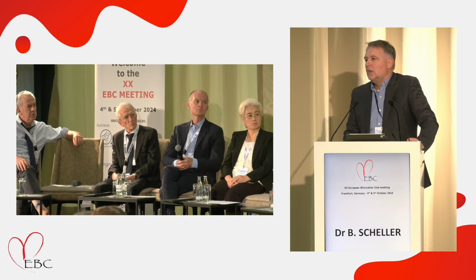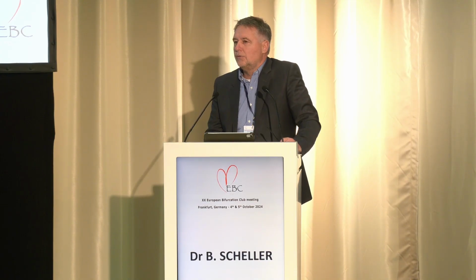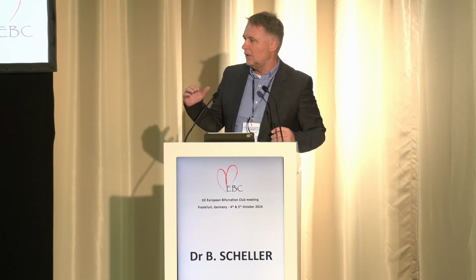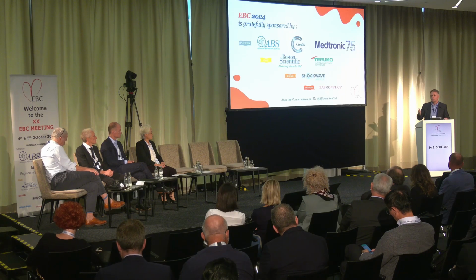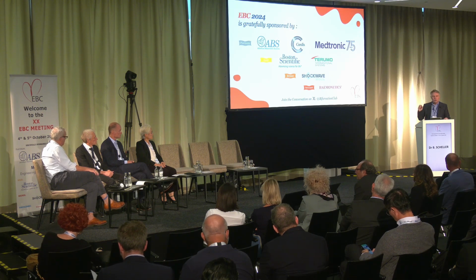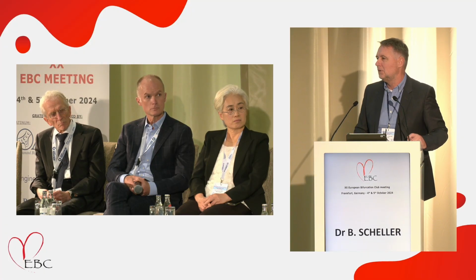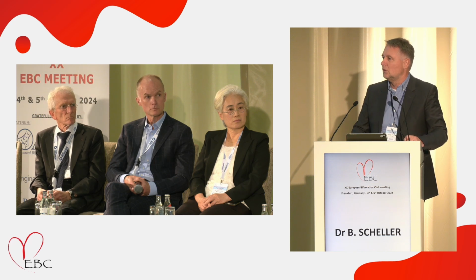So I meanwhile prefer starting with specialty balloons, cutting or scoring balloon. Why? Because at least at low calcification level, you have a better initial lumen gain. With scoring balloons, you have less dissection. You have dissection, but you have more controlled dissection. And I think that's key, and it's a one-to-one sizing. I know we discussed this several times, if we should go for smaller sizes or not, but meanwhile I think it's important to go one-to-one.